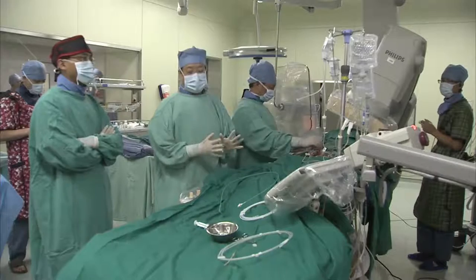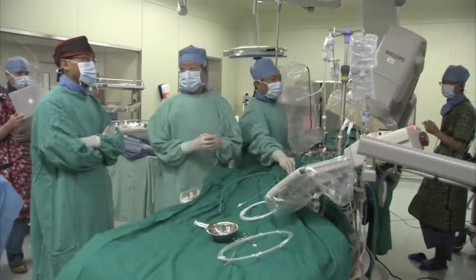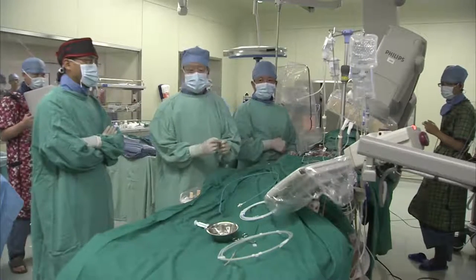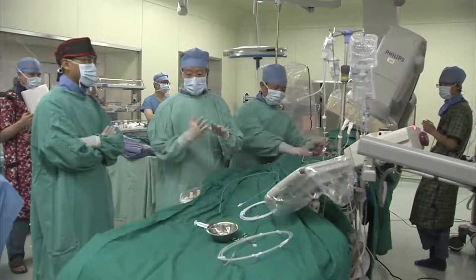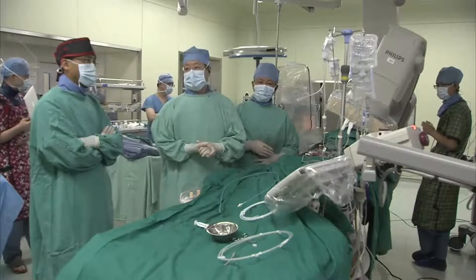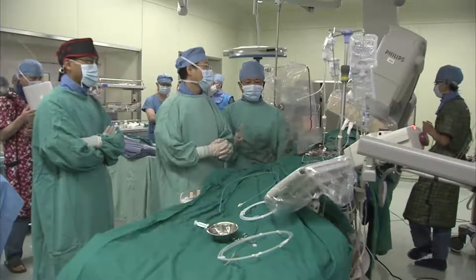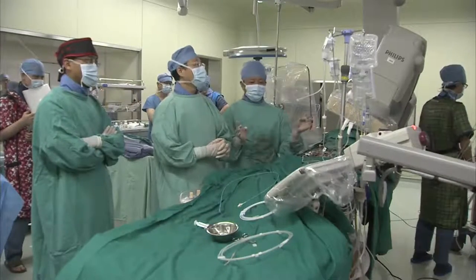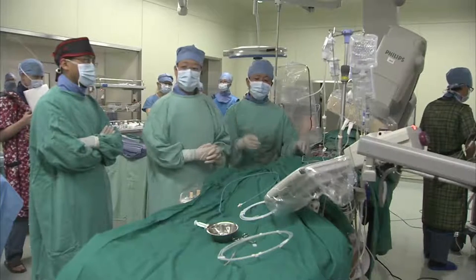Yeah, actually we have just two cases. One case jumped out, with the first generation of the previous venous valve. We have one case, but this one, because it has the skirt, is difficult to jump out, so we don't concern about this. That's why this valve should be positioned at the zero level or just 1 to 2 millimeters lower. So this is unique because of the skirt's design. For this patient, the balloon dilation was not total dilation, and finally we used the 20 millimeter new balloon to dilate. So it's open.